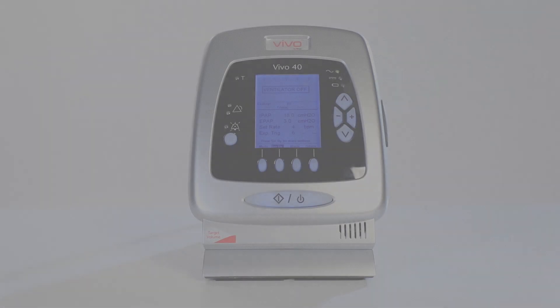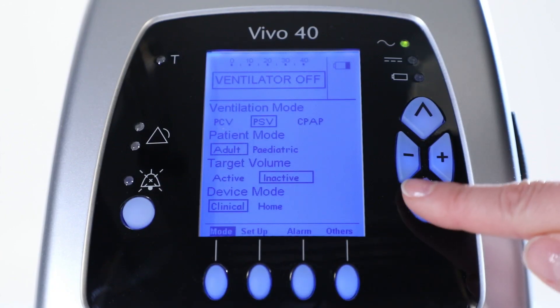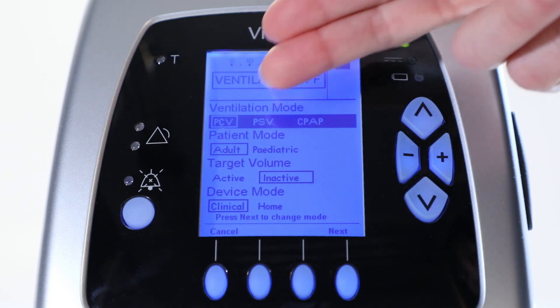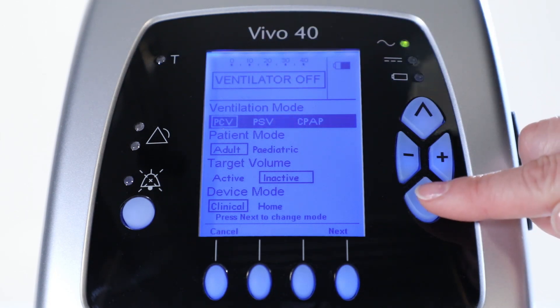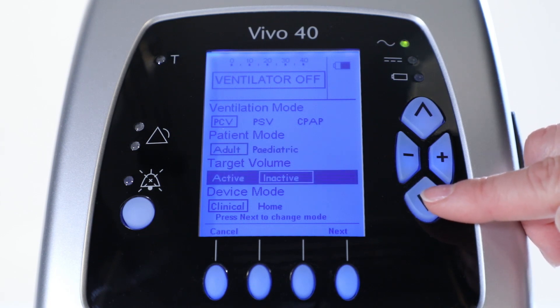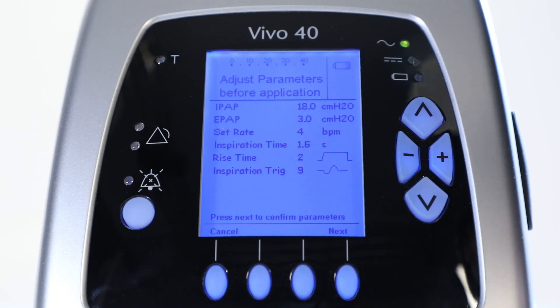Let's start by going to the mode section of the Vivo40 and select pressure controlled as the ventilation mode. As you see, PCV is selected. Then leave the adult patient mode and inactivate the target volume. Stay in clinical mode. Press next to change the mode and set the parameters.